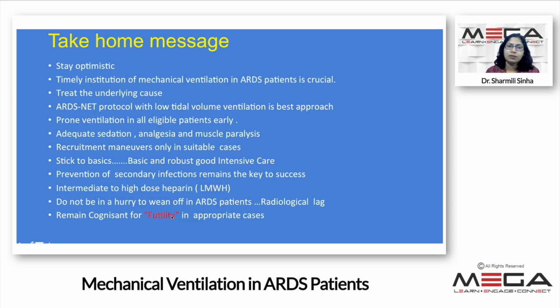Again, one word I will tell about, because we have always been emphasizing this low tidal volume ventilation in ARDS. Remember that all ventilation in the ICU is not ARDS ventilation. Suppose a patient is coming after a traumatic brain injury or from a craniotomy or laparotomy. All these patients, you do not think of applying it. These are not injured lungs. These are not diseased lungs. So you do not think of applying the ARDSNet protocol in these patients, because as I mentioned, this low tidal volume ventilation can cause hypercapnia, which is not good for the brain. Just aim for clinical targets of oxygenation and gas exchange and other normal parameters, as both my speakers have narrated well.